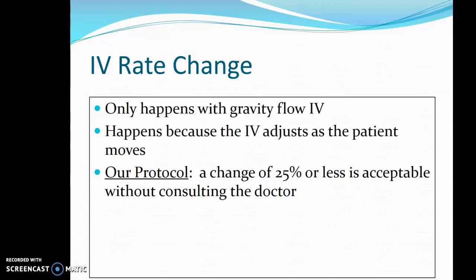Hello, we are going to be talking about IV rate change. This will only happen when we are dealing with a gravity flow IV. When we're using an infusion pump, the pump will automatically adjust to the patient's movement and it'll adjust the pressure and therefore adjust the rate so that it stays right on track.